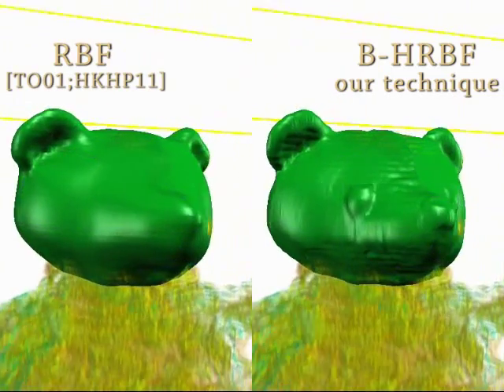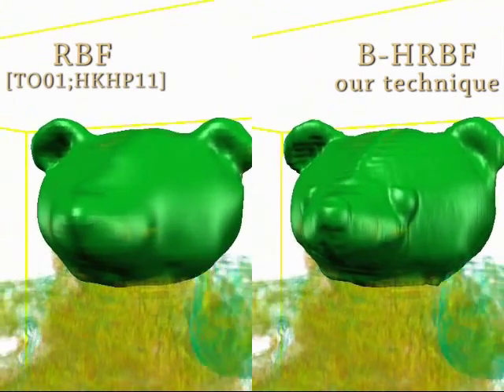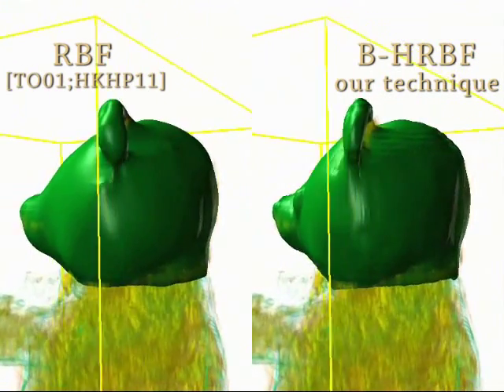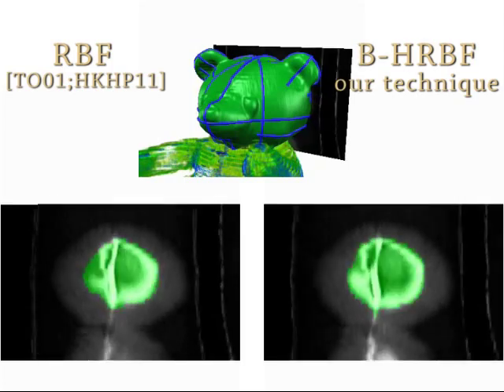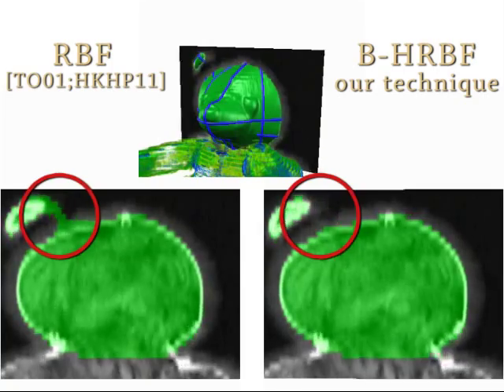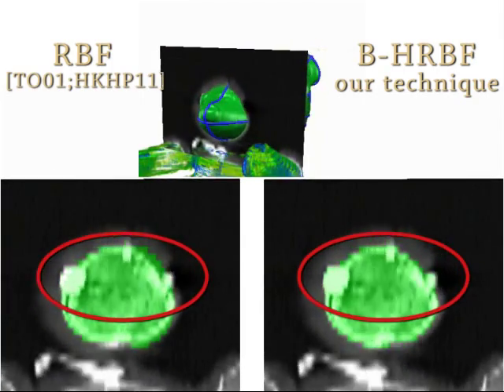This clip shows the side-by-side comparison of a previous RBF-based method and our technique. We cut out a phase region from a CT volume of a stuffed bear. While the RBF-based method only smoothens the boundary shape, our method fits the boundary to high contrast image edges.